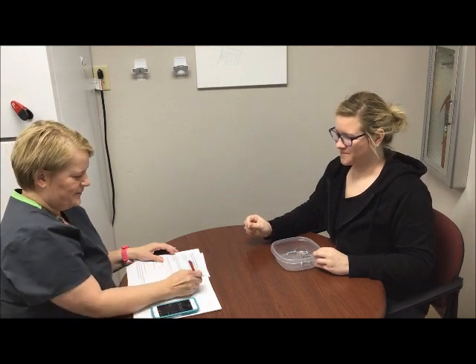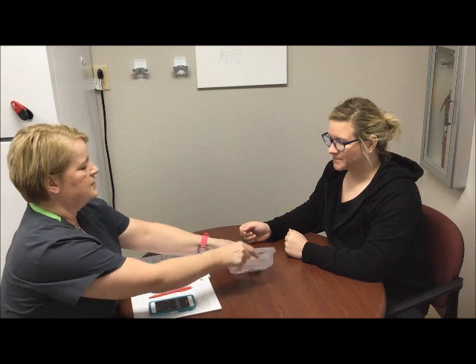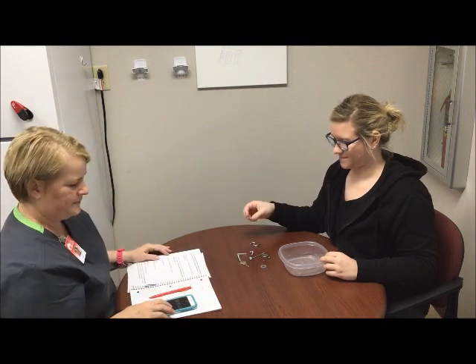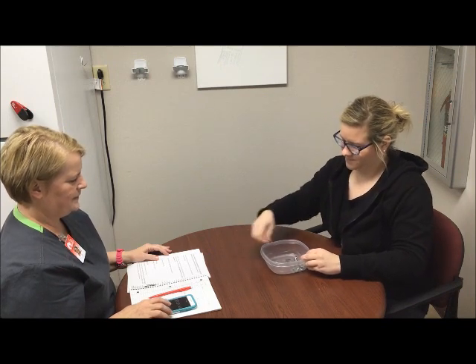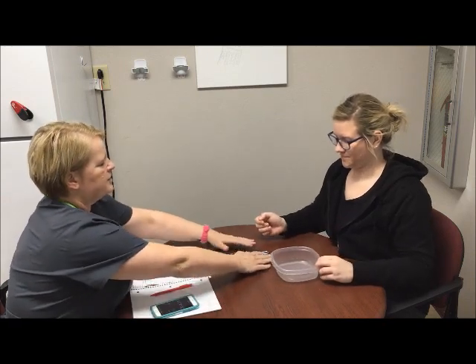Okay. Good. [Trial 1 complete.] We'll do it again. I'm going to put these all spread out for you so you can easily reach them. Ready? Go. [Trial 2 complete.] Okay. One more time on the right side.